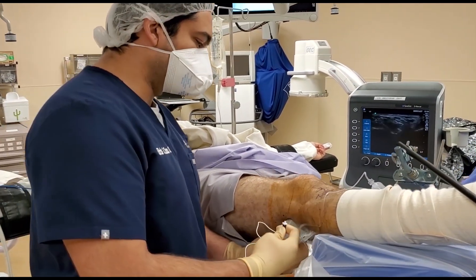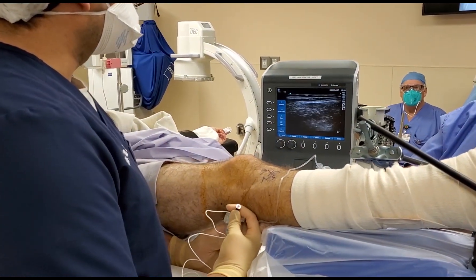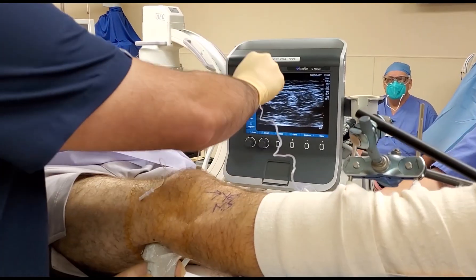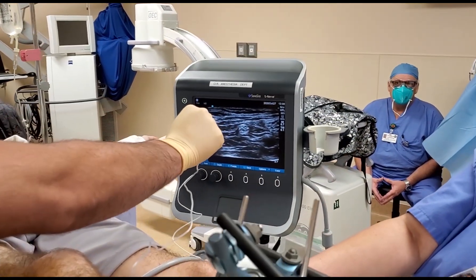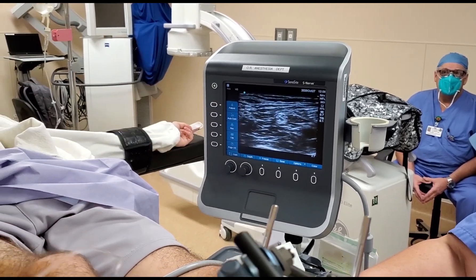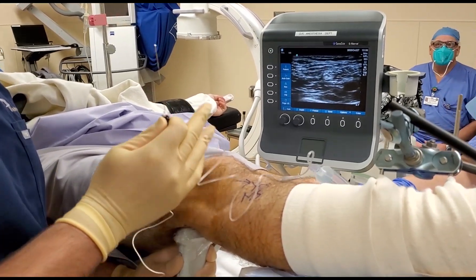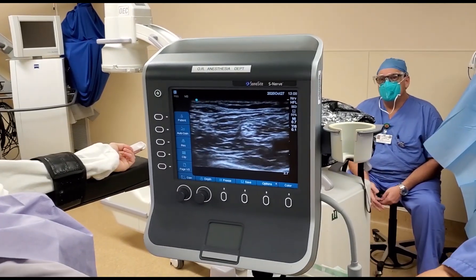I'll go from the posterior part of the knee to identify the sciatic nerve. There's a great image right here in the middle of the screen — this is the sciatic nerve. If you see two nerves, that means you've gone too far distal and the sciatic nerve has already branched into the common peroneal and the tibial nerve. So you want to bring your transducer more proximal until the two nerves converge onto the sciatic nerve.